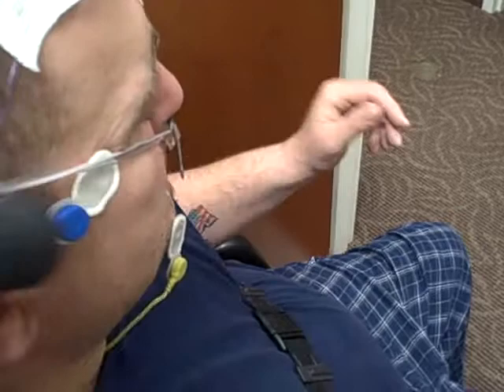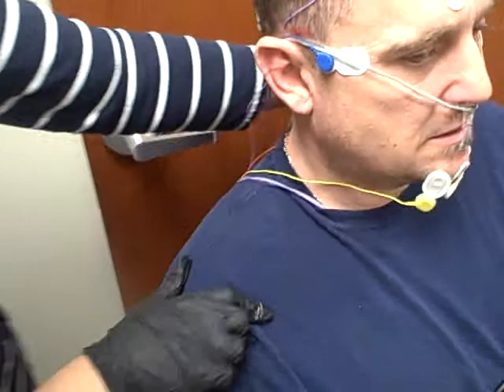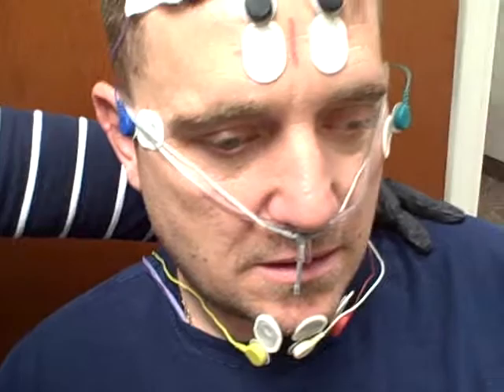We take this whole apparatus and have the patient guide it into their nose, then just slightly tighten it into the back. You want to make sure that it is centered in the patient — it should be positioned and looking just about like that.